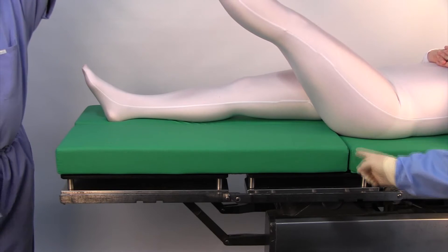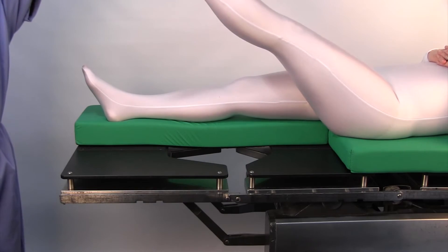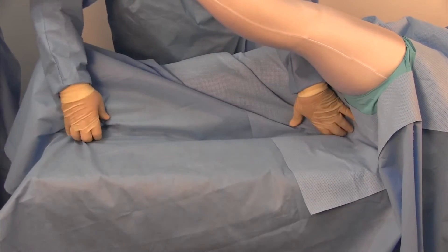When prepping the leg for surgery, remove the section of the OR table pad that is located under the operative leg. Once the patient has been draped, push a little of the table drape towards the patient's gluteal region.